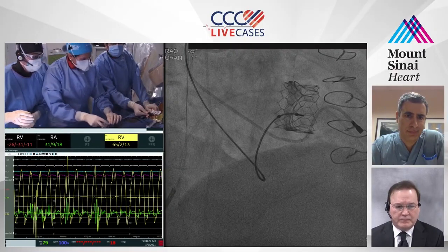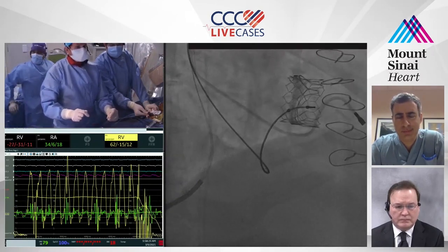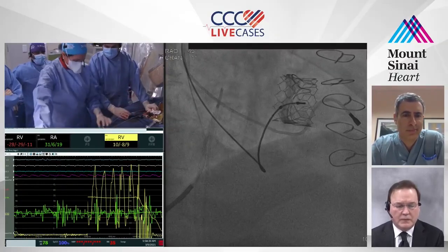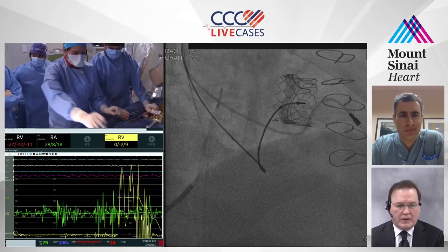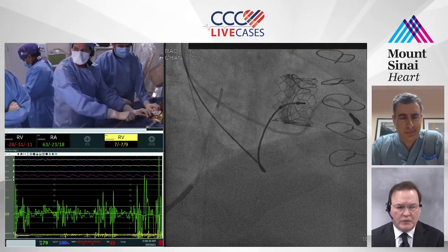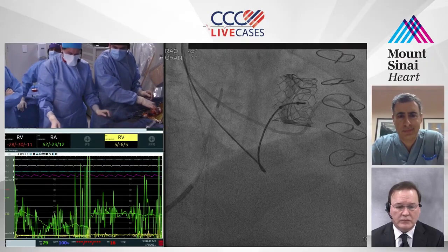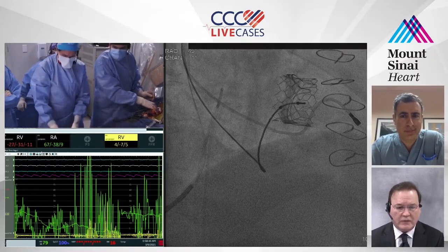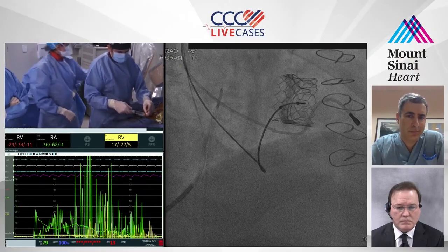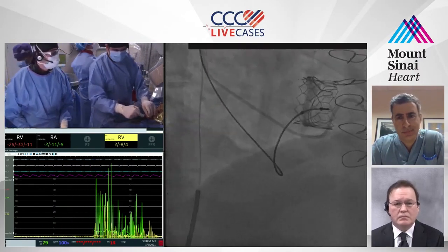Now, Gilbert, what do you think about fixing the mitral valve in the future on this particular case who had moderate plus MR now? Let's see how he does at 30 days, and then we'll reassess. I think that's what you usually do. Because there was only tricuspid stenosis, there was no TR, there's only benefit now. You can speculate with TR that it is an escape for the RV pressure. And the pigtail was removed after putting the wire. So the valve does not change, not affected.